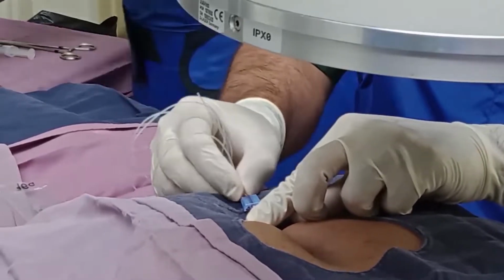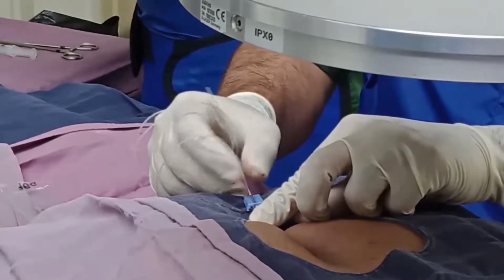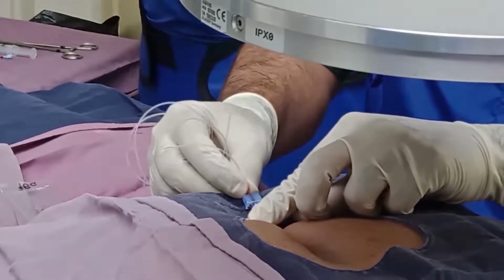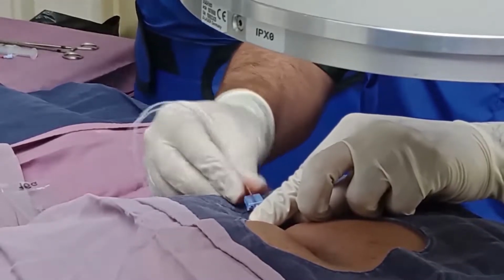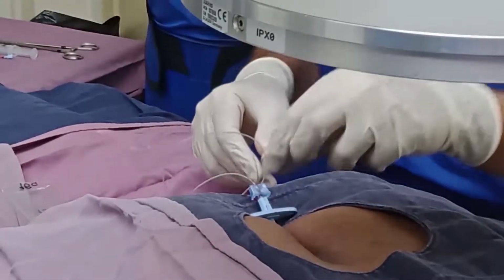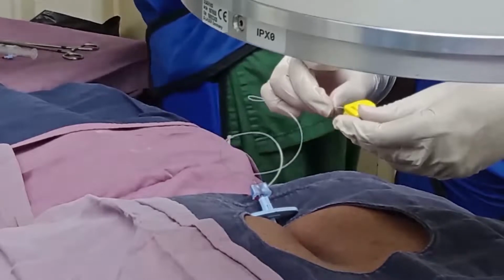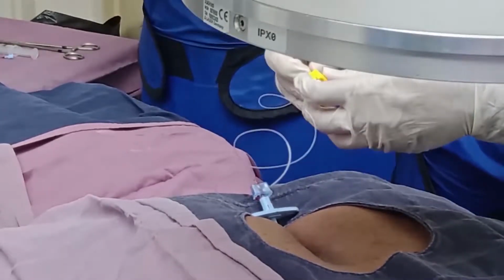The epidural catheter is being threaded in through the Tuohy needle. It's important to warn the patient regarding the threading of the catheter, as they might feel a little bit of a sharp pain.